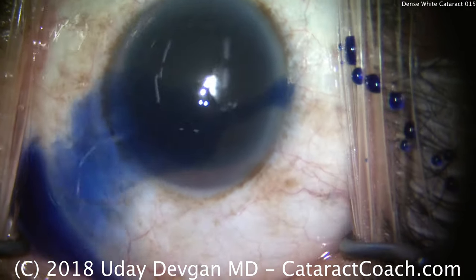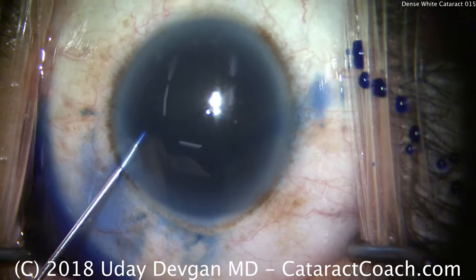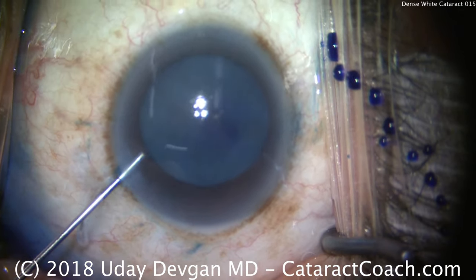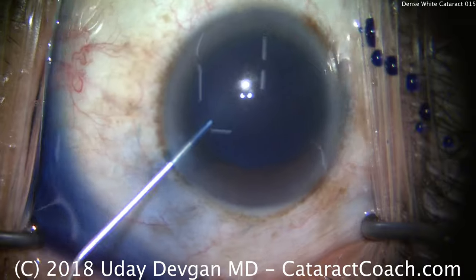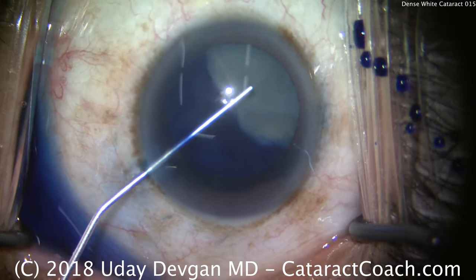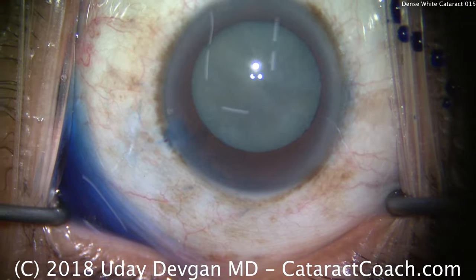We'll instill some trypan blue dye in the eye to stain the anterior lens capsule. We'll now dilute the dye with anesthetic — that gives us a better view. And now, of course, fill the anterior chamber with viscoelastic. We're going to use a dispersive viscoelastic here to fill the AC and protect the corneal endothelium. Important as you inject this to try to get the blue dye out in an exchange, like we did here. That looks great.